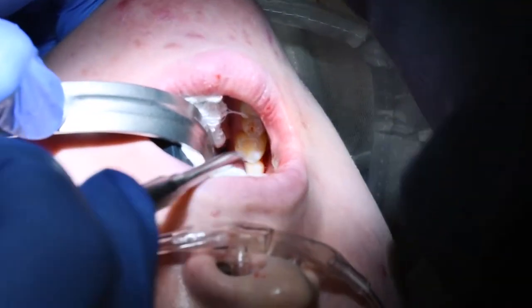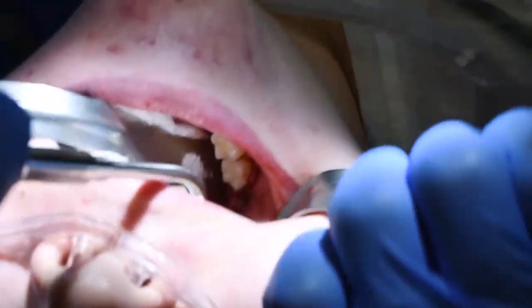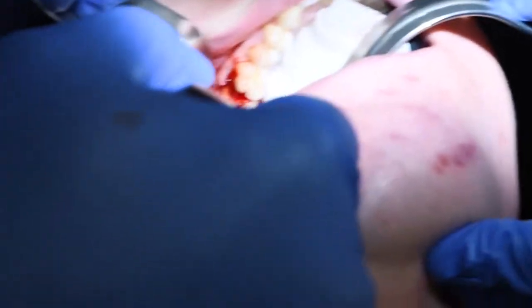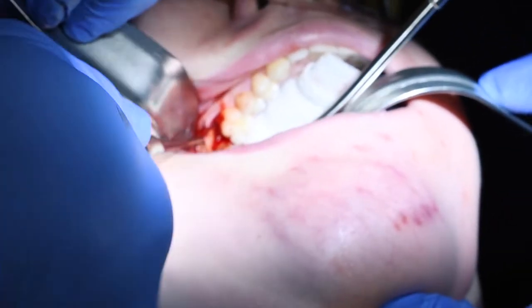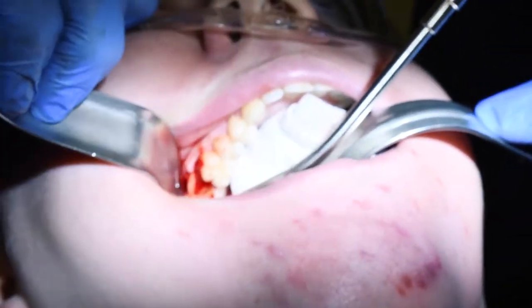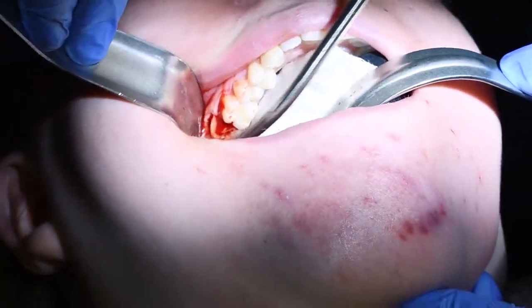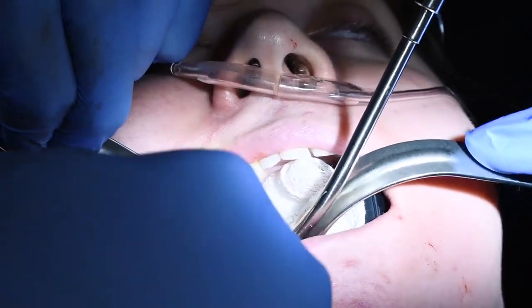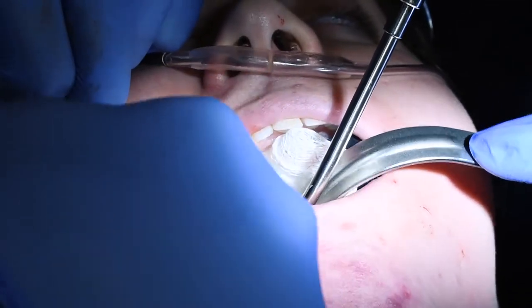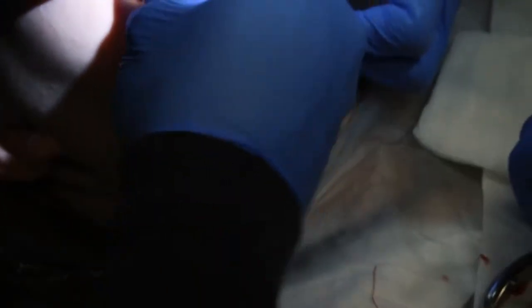Now on the top, I need a small straight elevator — remember, I've already raised my flap. Right there is the tooth. I get right in this little groove, wiggle, rotate, and then it comes out just like that. There's the tooth — grab onto it. I'm going to make sure we have any soft tissue in that area out. There's that follicle tissue — Justin always tries to get me to throw these at the walls, but I think that's unprofessional, so I don't do that.